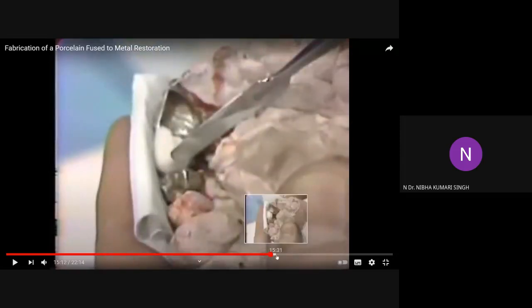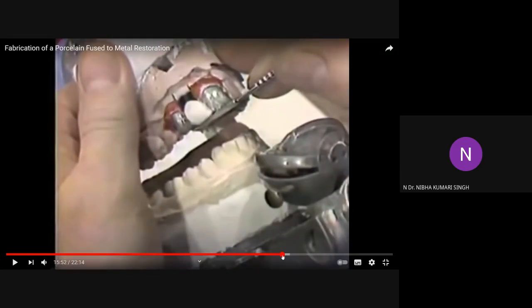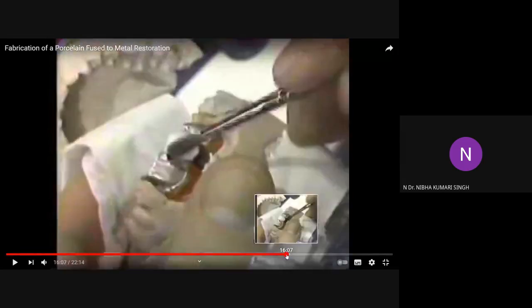Okay, after the incisal porcelain is applied, finally you have to go for the application of glaze. What is glaze? I'll be telling you. So glaze is nothing but a highly polished layer which is applied. It is usually of two types: add-on glaze, also called overglaze, and self glaze, also called auto glaze.